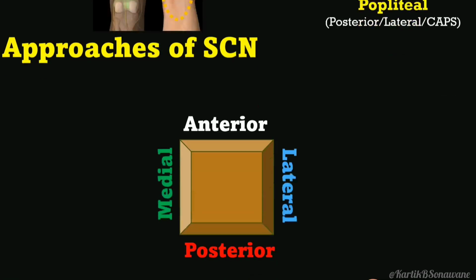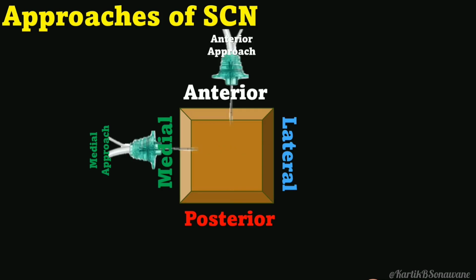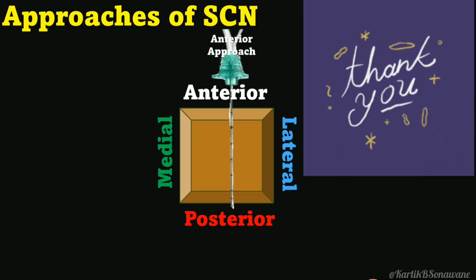The terms anterior, posterior, and lateral approaches are based on needle entry directions. In posterior approach, the needle goes from posterior to anterior. In lateral approach, the needle goes from lateral to medial, and in anterior approach, the needle goes from anterior to posterior.